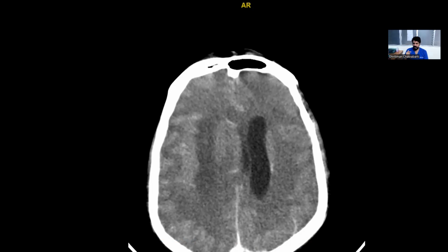This is the method which is basically published by the Brain Trauma Foundation guidelines. There are Brain Trauma Foundation guidelines for neurosurgeons also. So this is published there. Okay, so you should be answering this in your viva, as well as try to use this when you are doing your trauma cases. Okay, please do not use the midline from the nasion to the inion.